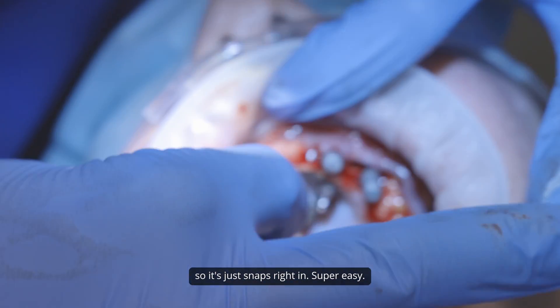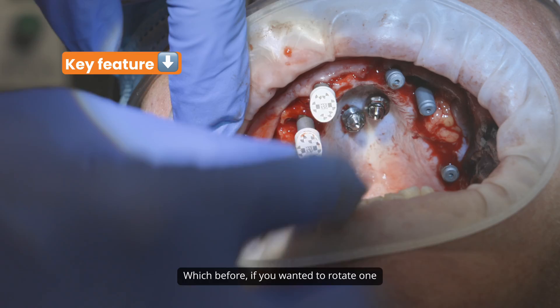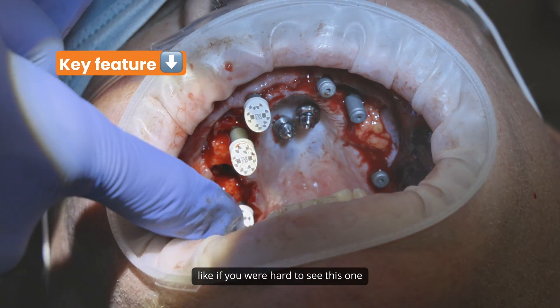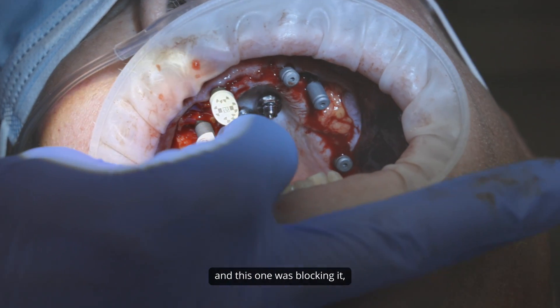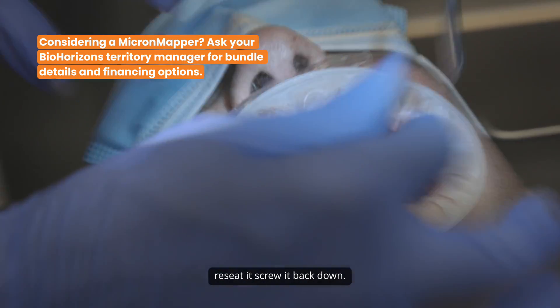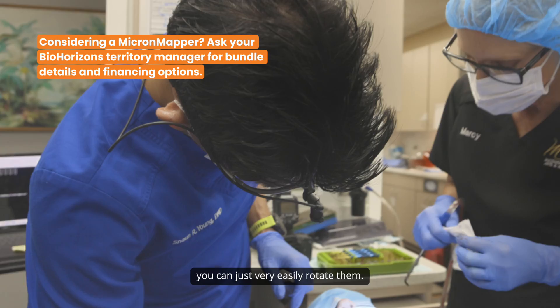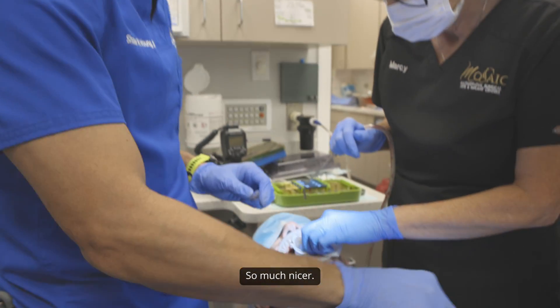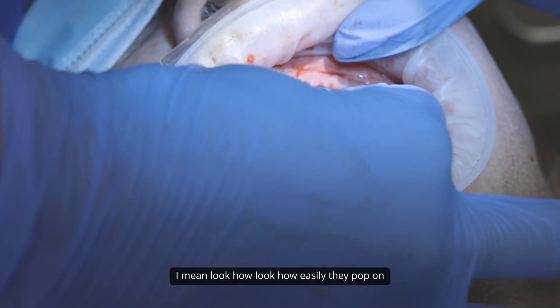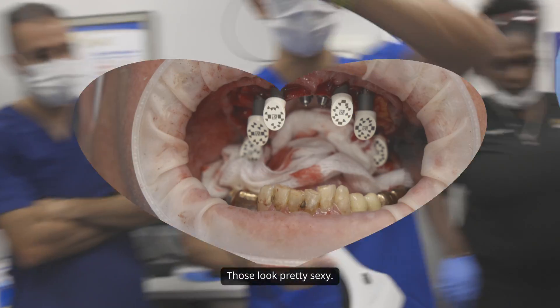This just snaps right in — super easy. And then you can rotate them, which before, if you wanted to rotate one because it was blocking your view, you had to unscrew it, reseat it, and screw it back down. With these ones that snap on top of the tie bases, you can just very easily rotate them. Look how easily they pop on and go on. Those look great.